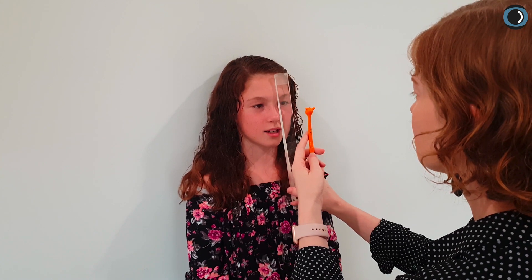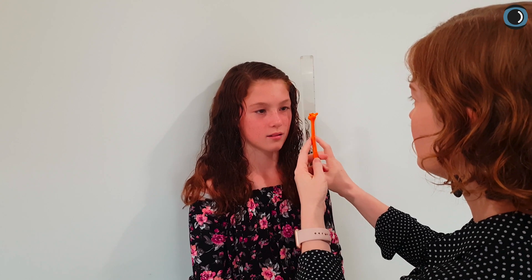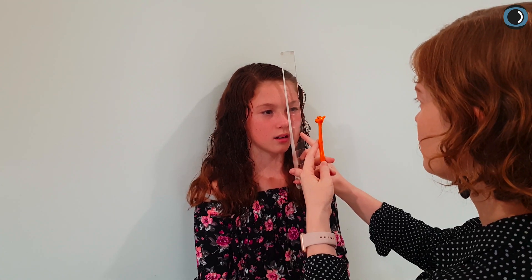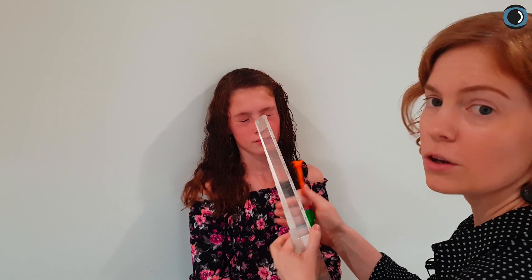We're doing jump vergences here, which are a little bit trickier than smooth vergences. I'm using a refractor head, and we're looking for that divergence and steadiness of both eyes. She's aced that and has gone straight up to 12 out of 12. Now let's have a look at her convergence.